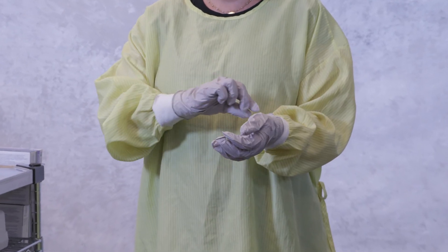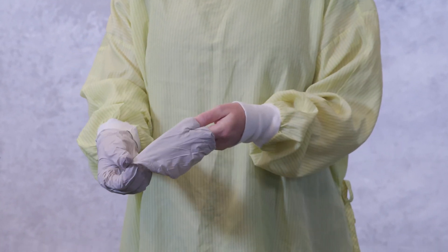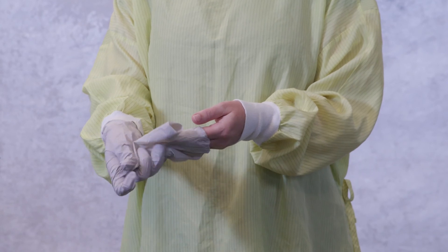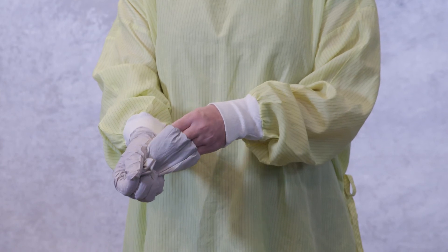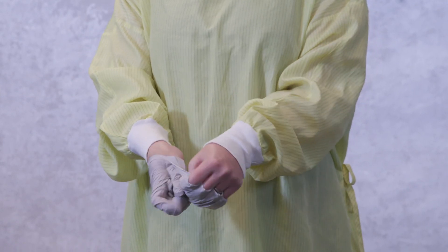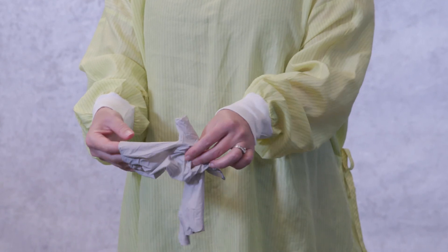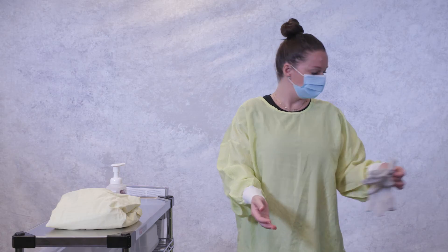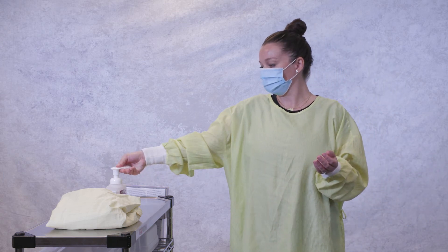First, remove and discard gloves. Grasp the glove at the wrist with your opposite hand and slowly pull, turning it inside out as you remove it from your hand. Slide an ungloved finger inside the remaining glove, removing it so that it turns inside out. Discard both gloves at once. Perform hand hygiene with alcohol-based hand rub.